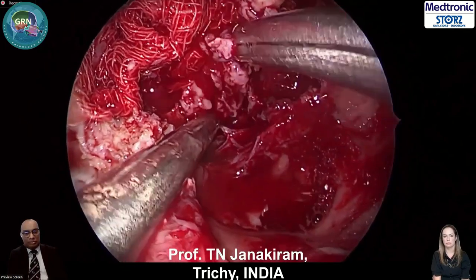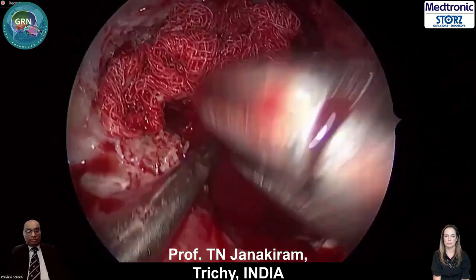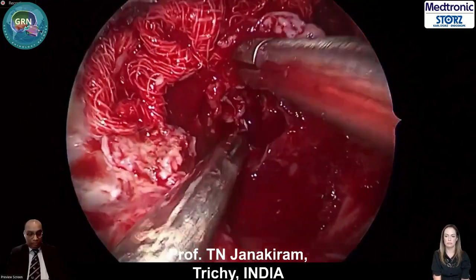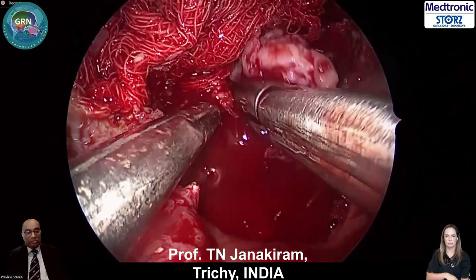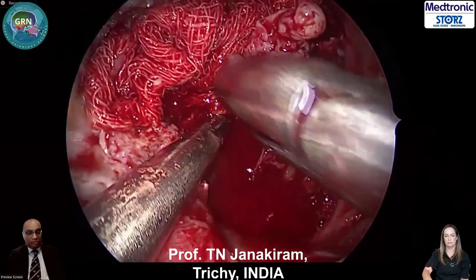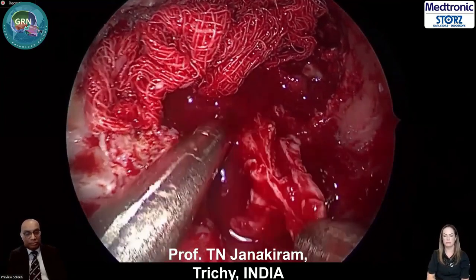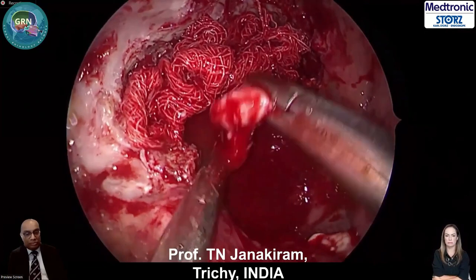Takahashi. Takahashi is not holding. Come on, come on. Let me take this out and then I will take that small part later. So you can actually segmentally resect it slowly, not a hurry at all. The thing is not holding. It's not holding, it's not holding.